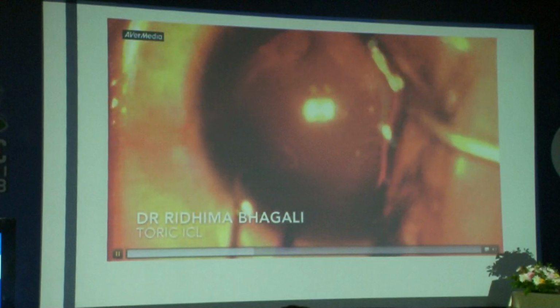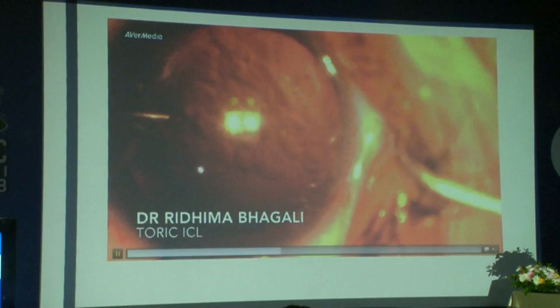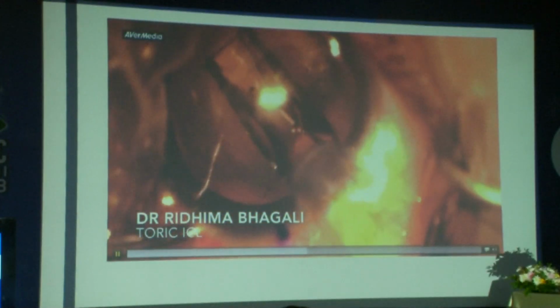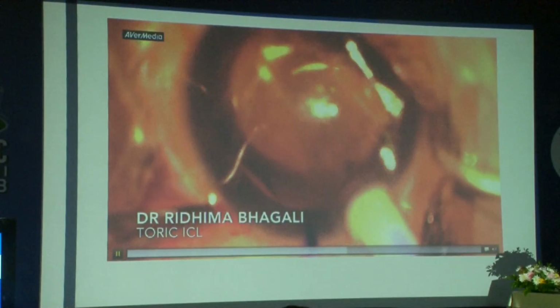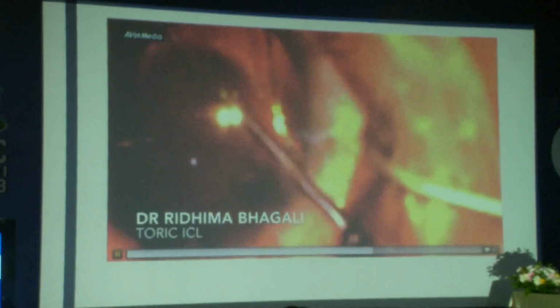The surgical steps as seen here, like after side ports and an HPMC viscoelastic, a 3.2 mm wound is done. The lens is always loaded as an inverse taco. And this is a slow implantation to show you, demonstrate the implantation and tucking in of the haptics.